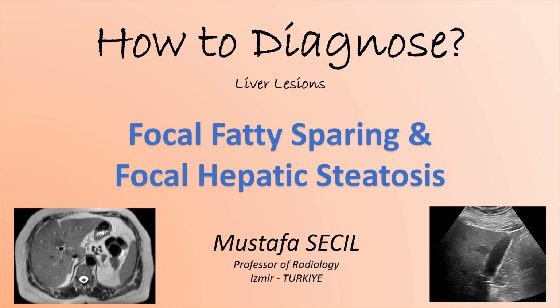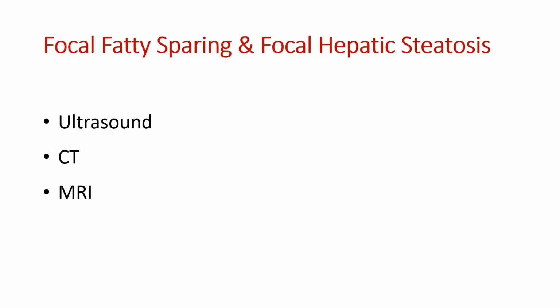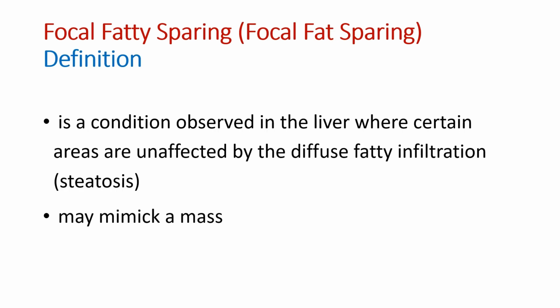This presentation will be about focal fatty sparing and focal hepatic steatosis. I will show some examples of ultrasound, CT, and MRI. Focal fatty sparing is a condition observed in the liver where certain areas are unaffected by the diffuse fatty infiltration. It may mimic a mass.